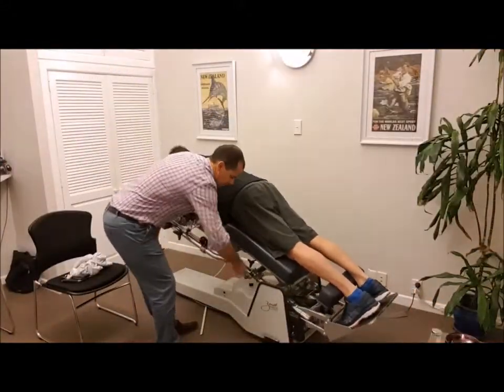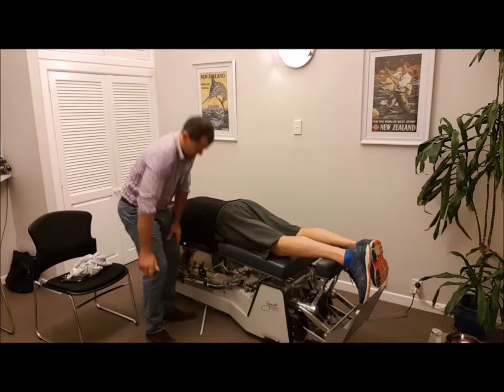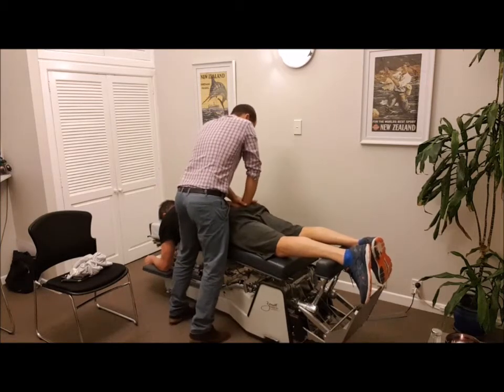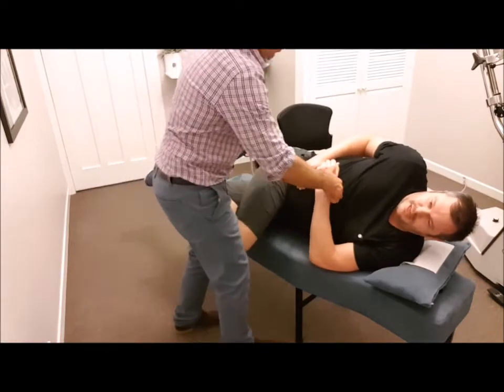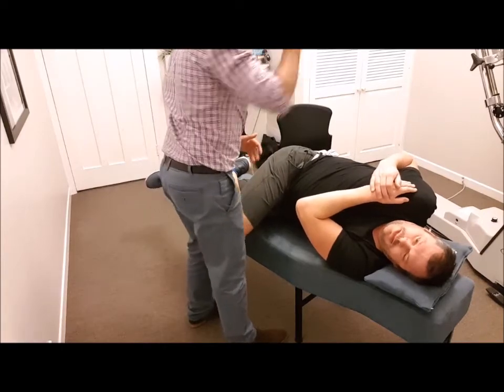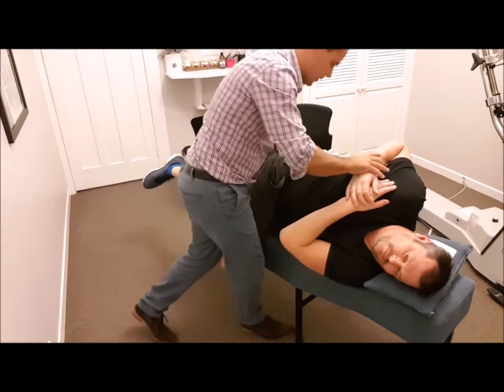Now the next thing we do is we're moving on to the drop table, because what we want to do is decompress that disc even further. We select either the pelvic section or the lumbar section, or a combination of both, and here our objective is simply to open up the joints into the lumbar spine and continue that decompression. Once we've decompressed that, we're going to move on to a side-lying adjustment — utilizing more than one technique to maximize it. So we've used these three techniques to minimize the amount of compression on that disc and nerve root, and maximize the recovery for the patient.